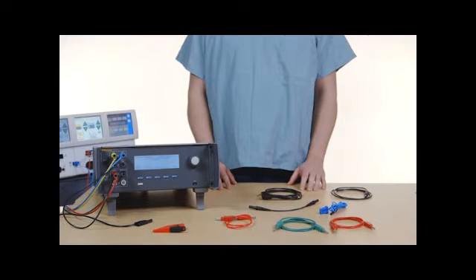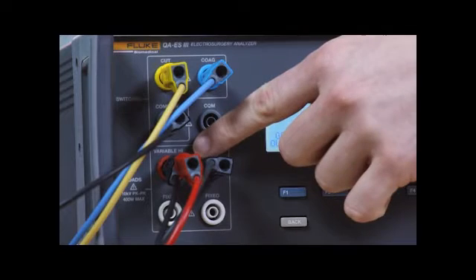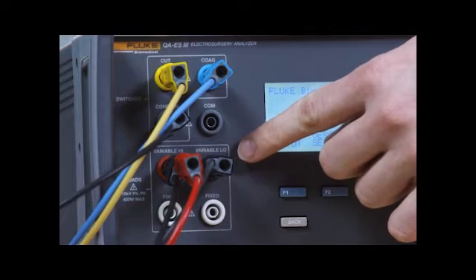For all HF leakage measurements, the QAES-3 places a 200 ohm load resistance from the variable high jack to the variable low jack and measures the leakage current through that load.